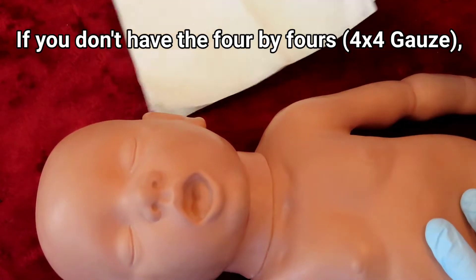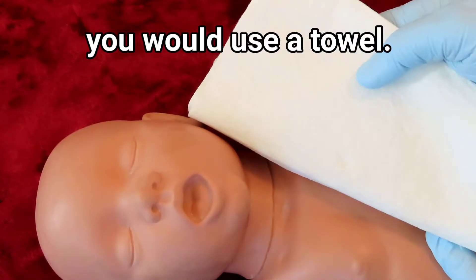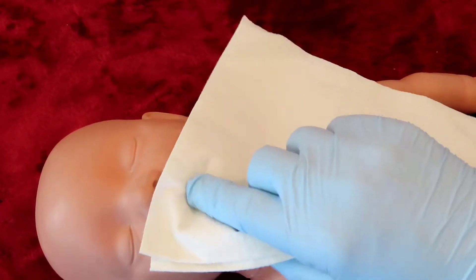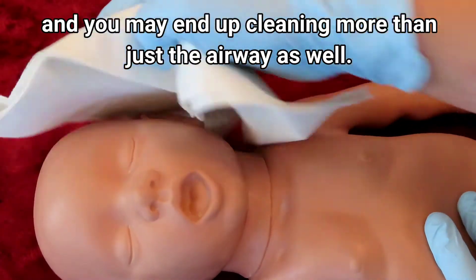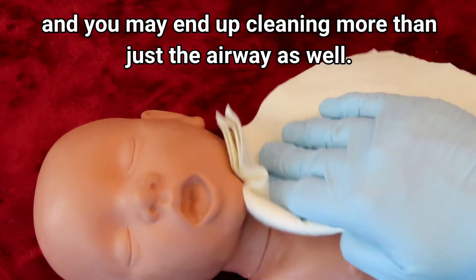You can use another 4x4 just for the nose. If you don't have the 4x4s, you would use a towel and do the same thing — clean the nose, and you may end up cleaning more than just the airway as well.